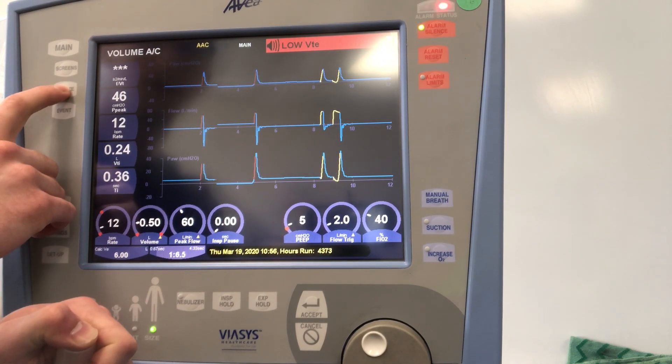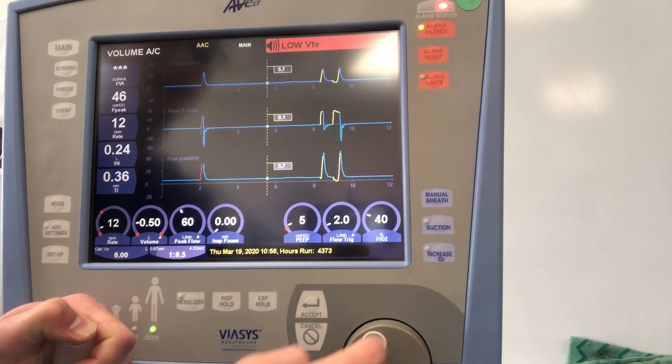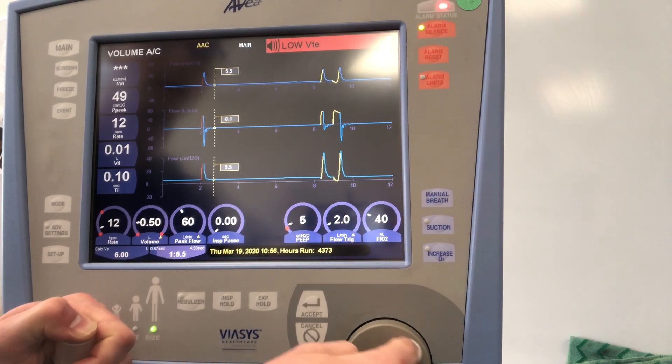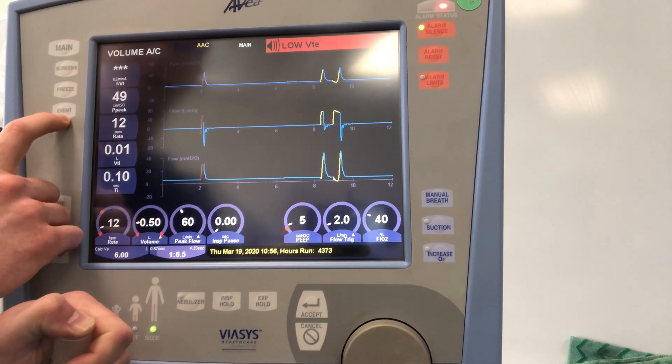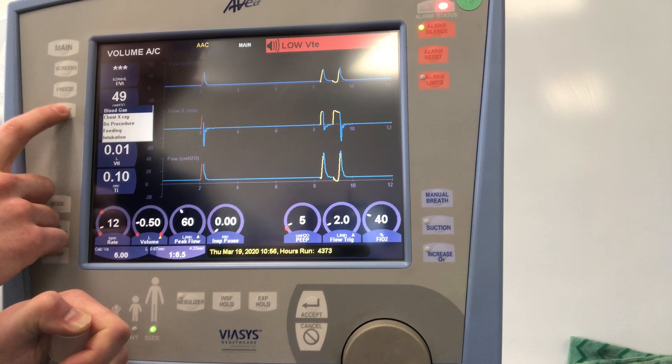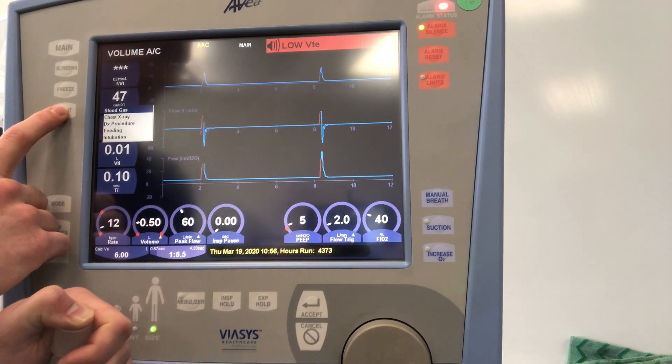You have the ability on the Avea to freeze the screen. Tap freeze, you can scale back and measure something like your PIP or plateau pressures. We also have the ability to input events — this is probably not going to be applicable; it's rarely used in clinical practice.